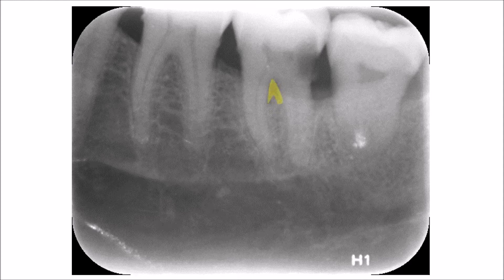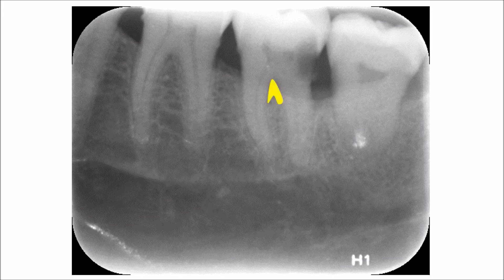In this radiograph, the area highlighted in yellow shows that in the lower second molar, the level of bone has gone below the bifurcation area of the tooth. What makes it radiographically traceable is that you will see a radiolucency located exactly below the bifurcation area, as visible in this radiograph.